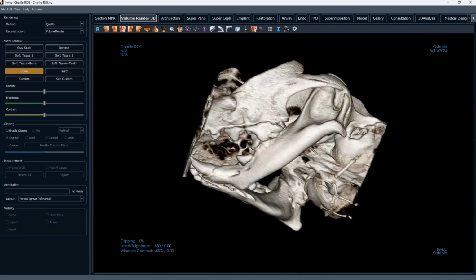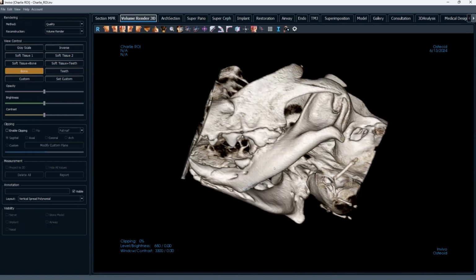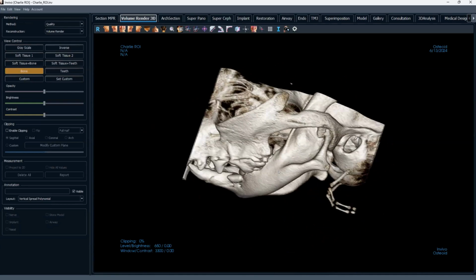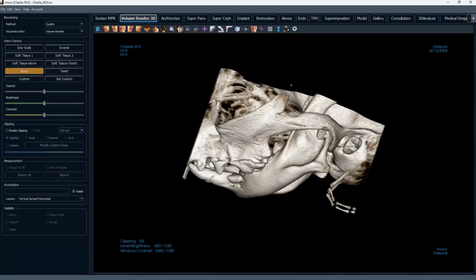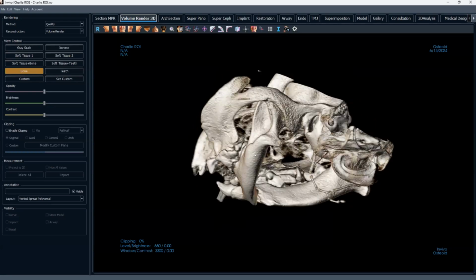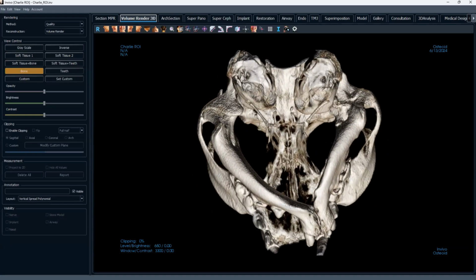So if you're looking for more detail, you might be able to go back to the machine like we can with our VetCat and get that resolution. But that means a whole other stack, a whole other in vivo file, so it's somewhat time consuming. But if you really need that detail, it's worthwhile.